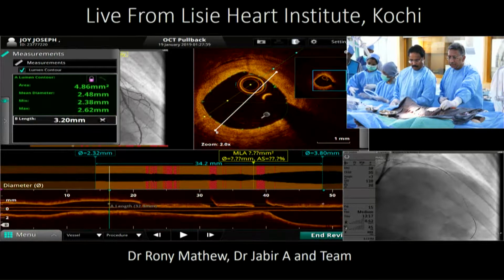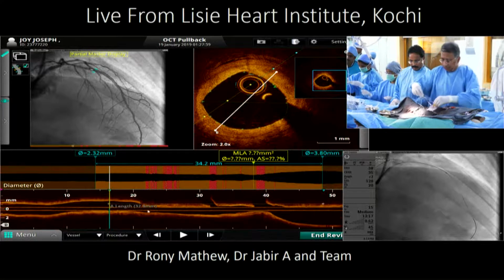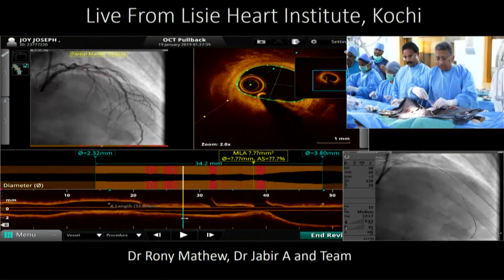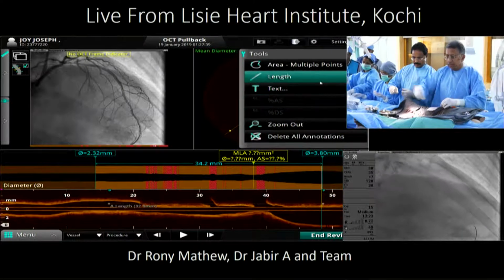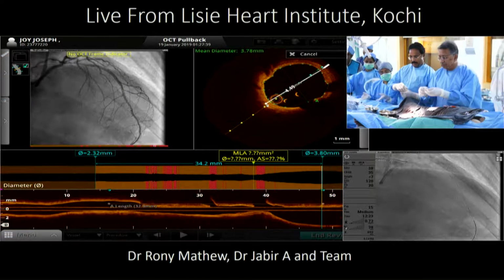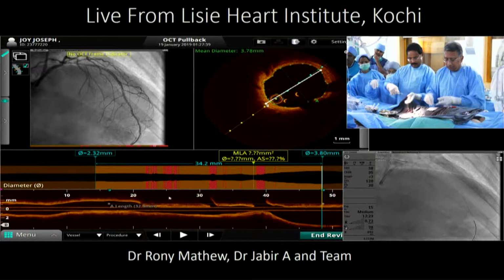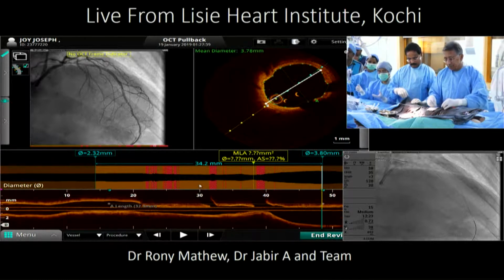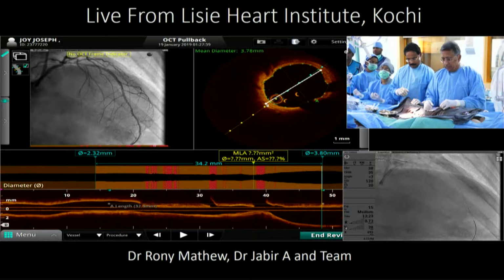I think you mentioned that, based on the angio, you wanted to use a 3.5 stent. So I think it's correct. And the proximal EEL to EEL diameter in the left main is 4.5. So I would go for predilatation. I don't know if you are keen about putting a wire in the circumflex or not. It's something that could be debatable. But I think using a 3.5, 32 or maybe 33 millimeter stent that you would post-dilate up to 4.5 in the left main would be a good option.